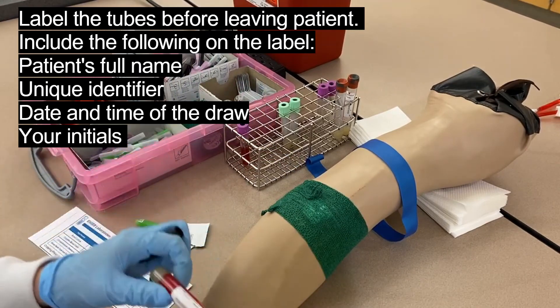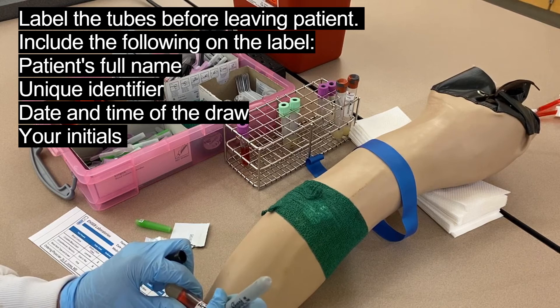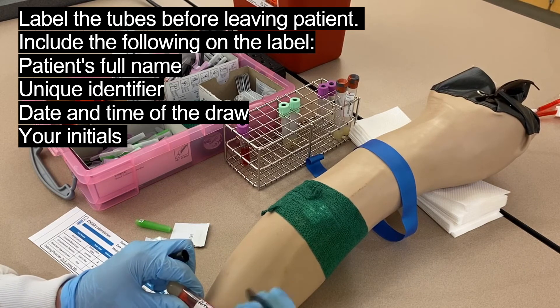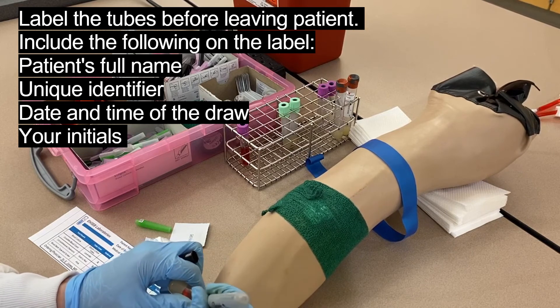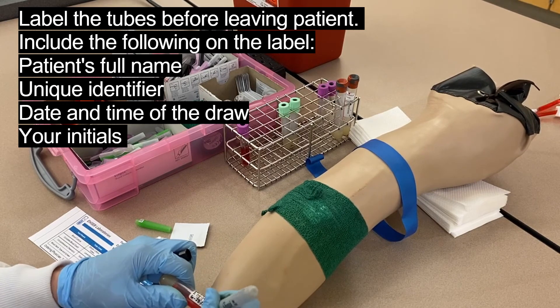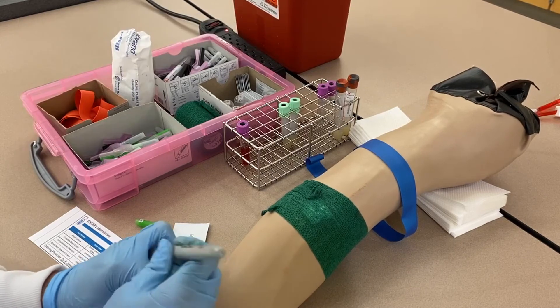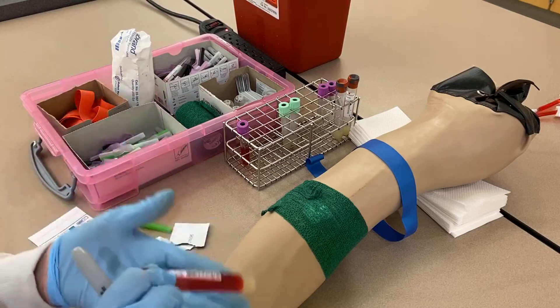You always want to label with the patient's first and last name, legibly. Many hospitals have barcode labels that print off so you don't have to manually label. Write a unique identifier — I'm using his birthday — along with the date of the draw, your initials, and the time of the draw. If the patient is conscious, it's good practice to ask them to confirm the label is correct.